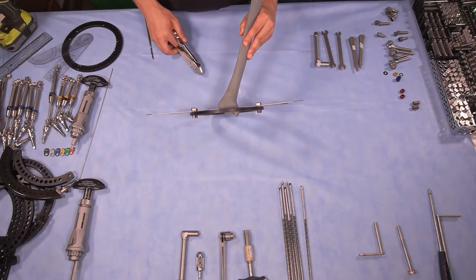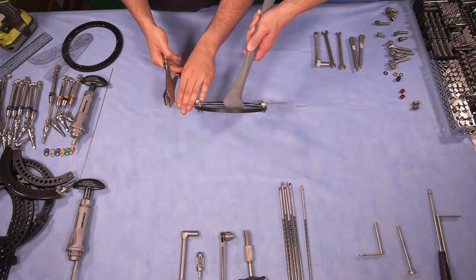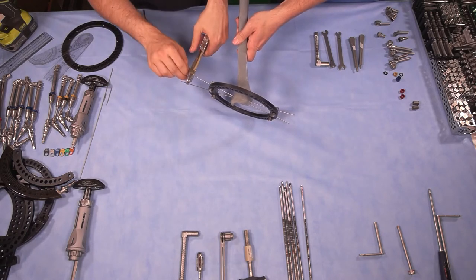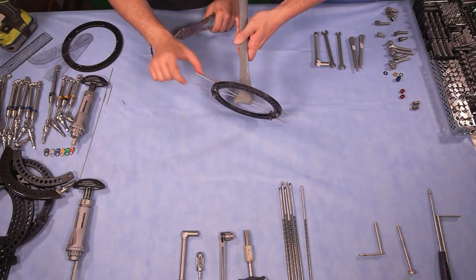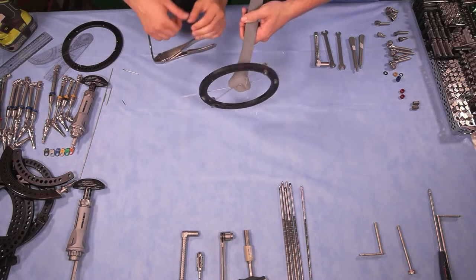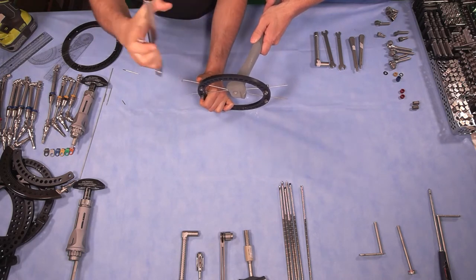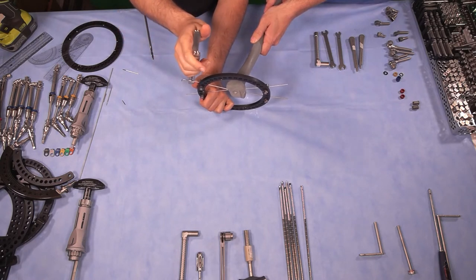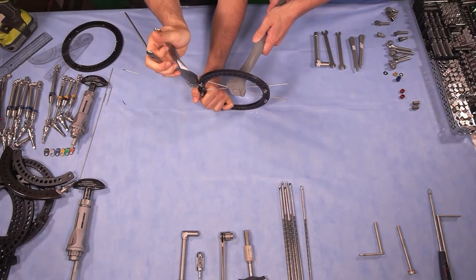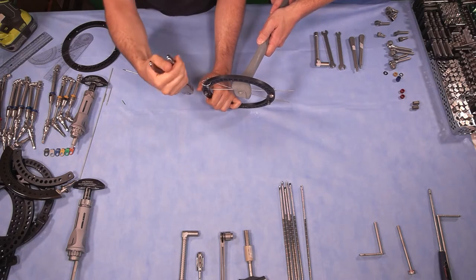Now I like to cut the wires about three finger-breadths away and curl them. That avoids assistants from puncturing their gloves, their hands, or the sterile field. Some surgeons will break off the wire directly from the ring, but the beauty of keeping some wire is that should there be any issue, you can uncurl and reuse it to reposition or re-tension. We curl the tip 90 degrees, curl the rest of the wire, and tuck it into a hole in the ring to protect it from rubbing.